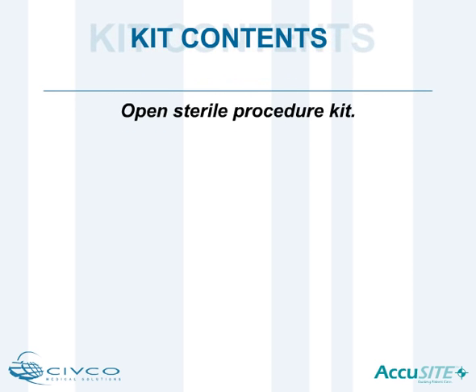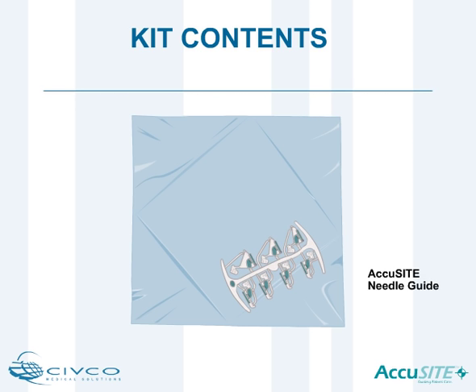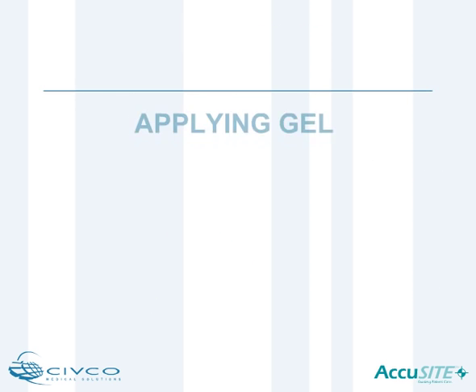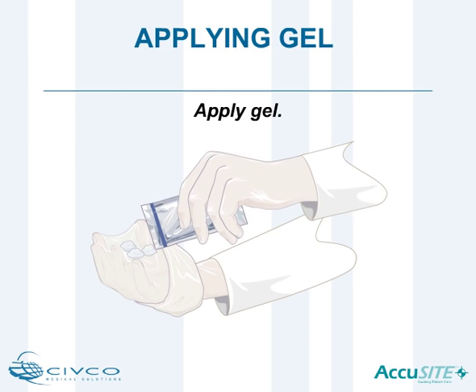Practicing sterile technique, begin by opening the desired AccuSight procedure kit. Inside each procedure kit, you will find an AccuSight needle guide, a protective transducer cover, a gel packet, and colored elastic bands.